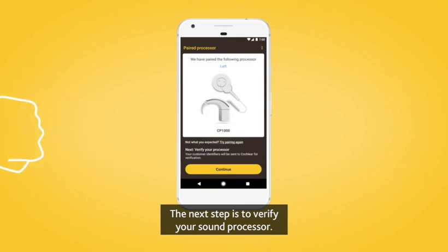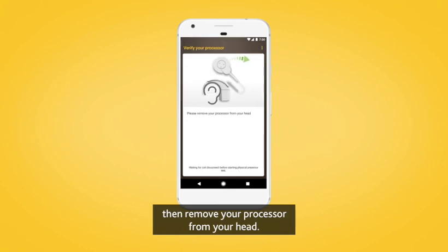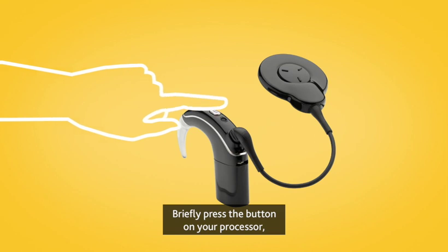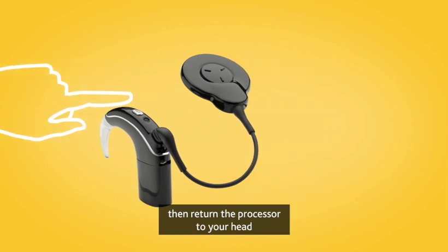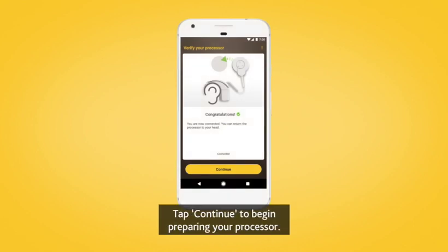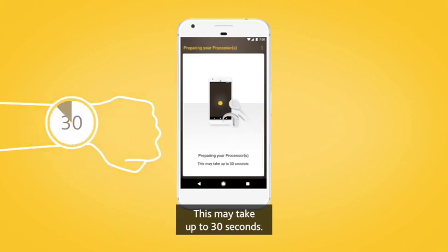The next step is to verify your sound processor. Tap Continue, then remove your processor from your head. Briefly press the button on your processor, then return the processor to your head when prompted. Tap Continue to begin preparing your processor. This may take up to 30 seconds.